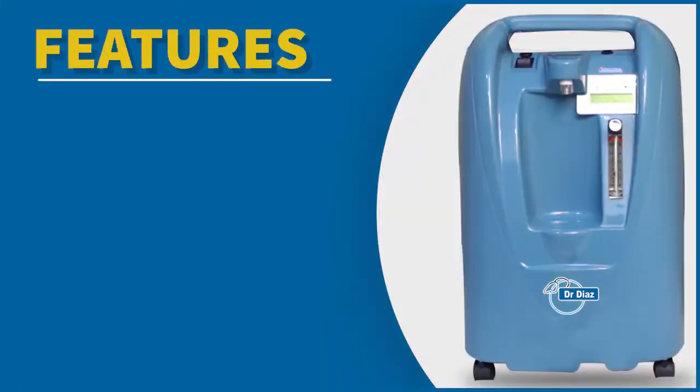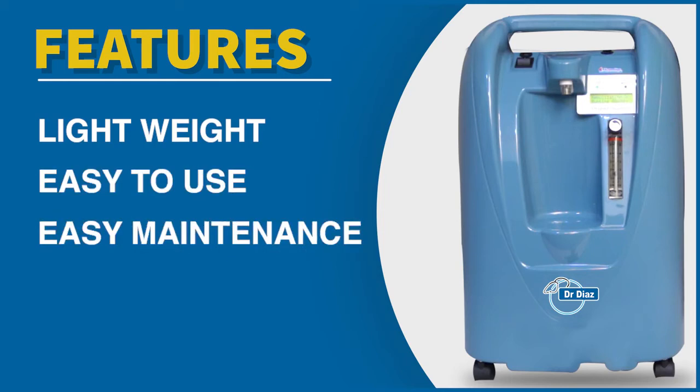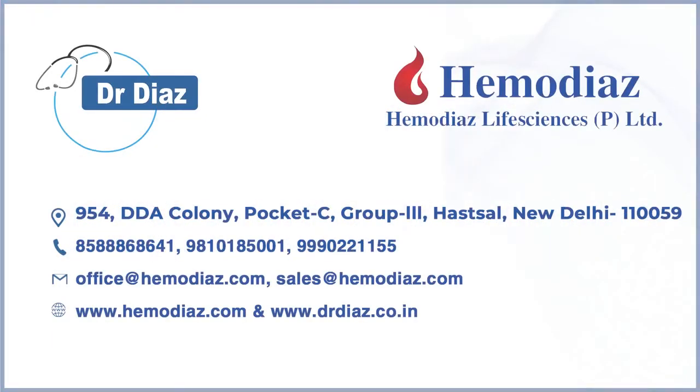Features: Lightweight, easy to use, easy maintenance. Purity of oxygen: 93%.